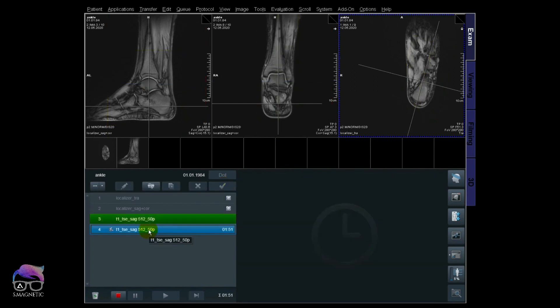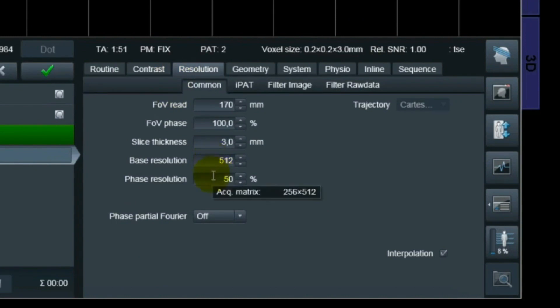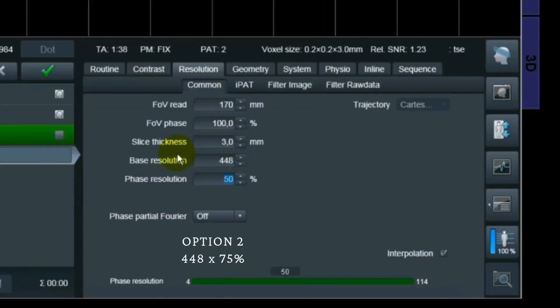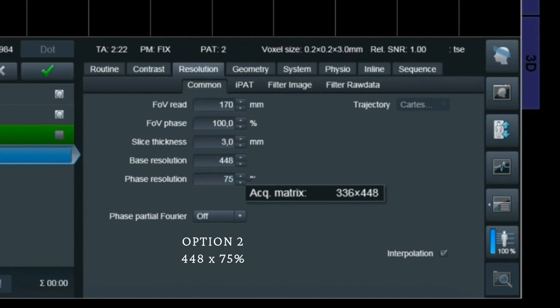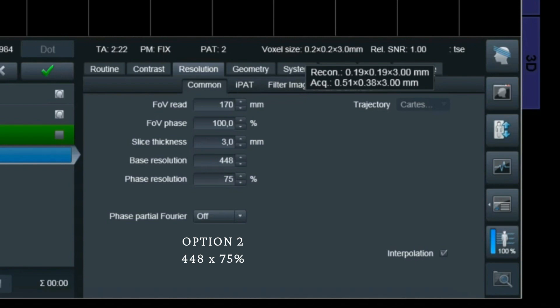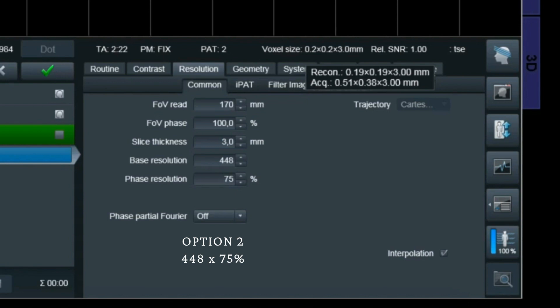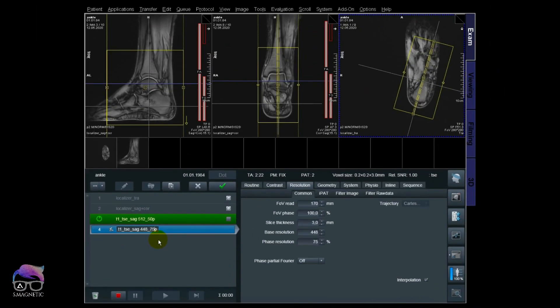Let's copy the sequence and change the base resolution to 448 with 75% phase resolution. Now we have 336 phase encodings instead of the earlier 256. I'll rename it so we remember. Checking the voxel size: we now have 0.51 × 0.36mm — still rectangular voxel sizes, but with more phase steps. It interpolates down to 0.19 × 0.19mm. Let's scan that one.